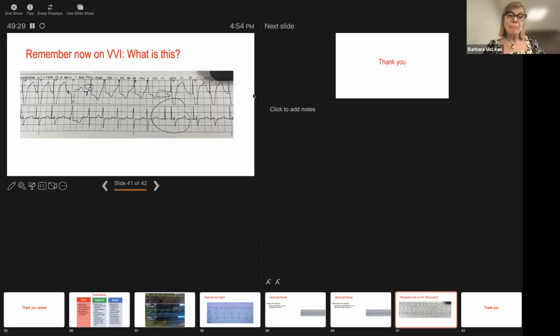So here's the thing. I can pretty much diagnose any failure with the temporary pacemaker, because if I can't do it from the EKG, I'm actually going to evaluate it by manipulating the pacemaker settings. Now, you don't do that. Your APPs do that. Your doctors do it. I do it because I've been blessed to do it, but I never do it without speaking to the physician or APP in charge first. I don't just go in and manipulate people's pacers.